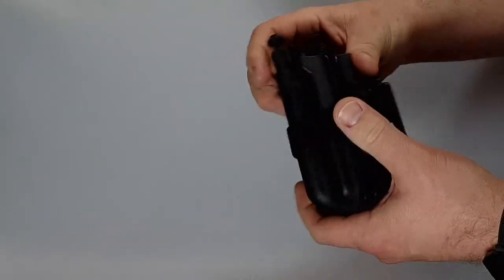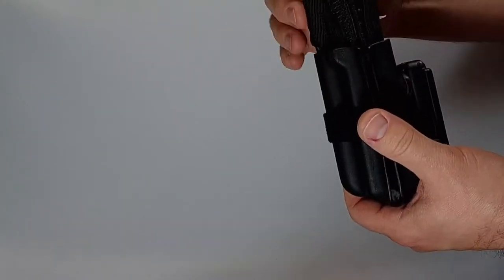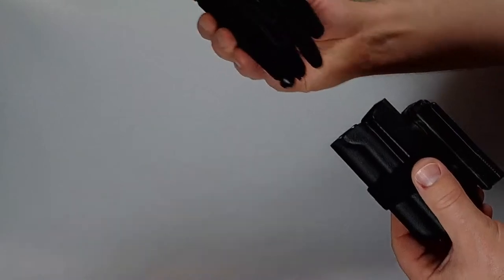This is going to hold it nice and secure. It's not going to come out even with some vigorous shaking, but it will come out one-handed if you need to. It'll come out just by pulling it up.